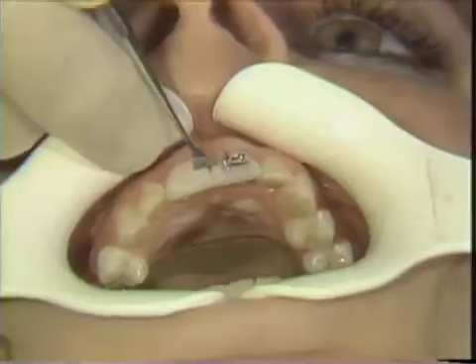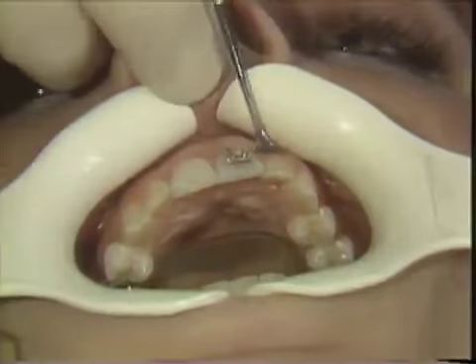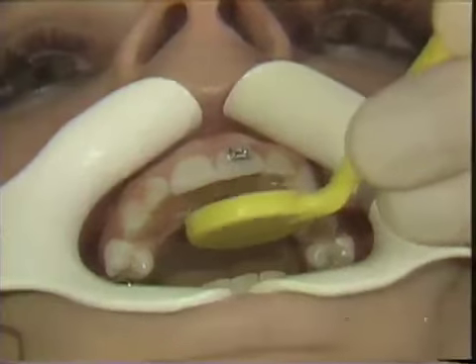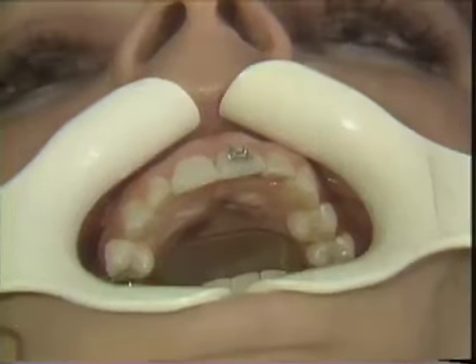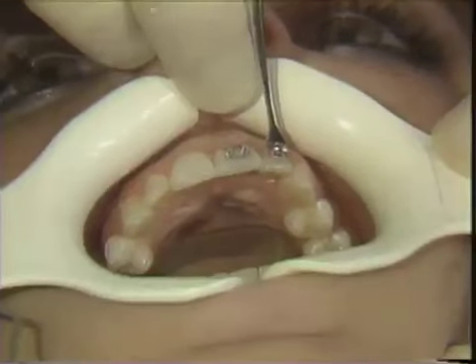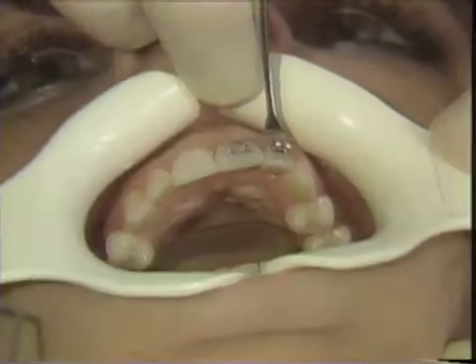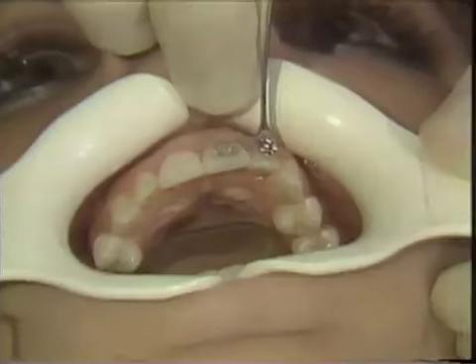Now at this point, go around the bracket to make sure that there is no flash, and then check the position again to make sure it's correct. The next bracket is the lateral incisor, and in this case we have already conditioned the composite restoration. I once again position the bracket, check the position in the mirror, and then press it to place.